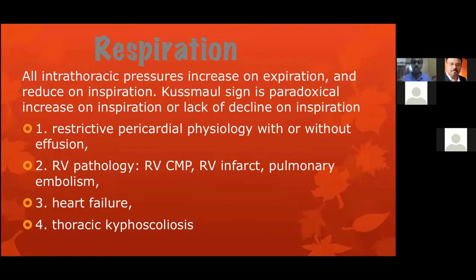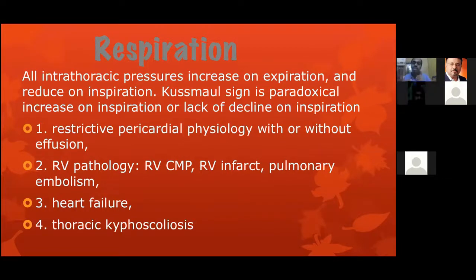Number three, the pulmonary artery has become more compliant during inspiration and allowed a lot of blood. All these three phenomena, that is, the inspiratory fall in the intrathoracic pressure reflecting on the intracardiac pressure, the inspiratory increase of right atrial inflow causing increased right ventricular ejection, and increased pulmonary artery compliance caused by the expansion of the chest, have resulted in a fall in the right atrial pressures. But in constrictive, rigid pericarditis, the increase in the inspiratory return of the superior and inferior vena cava is not transmitted to the intracardiac pressure.